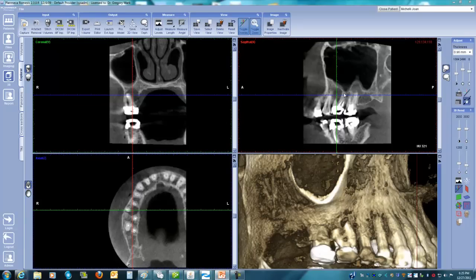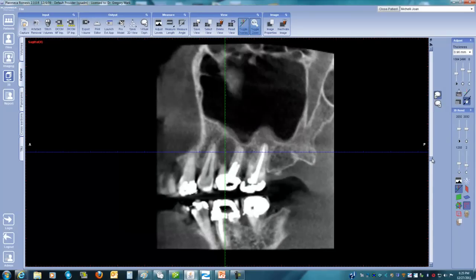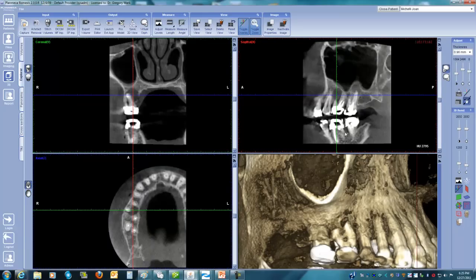You can see on the 3D pictures there is a mesial canal, a root canal failed. There is also a fracture on the same tooth, a vertical fracture. If we look at this patient's 3D, from this view we can see how big the lesion is, and the good part is there is no sinus connection between the lesion and the sinus itself.